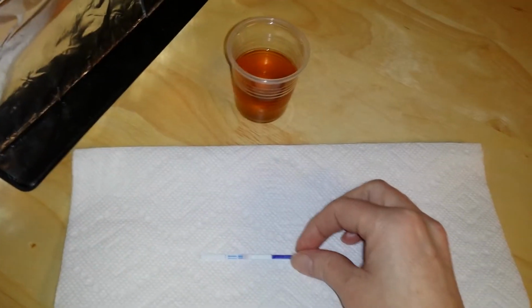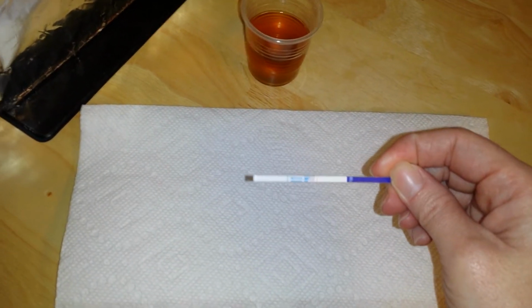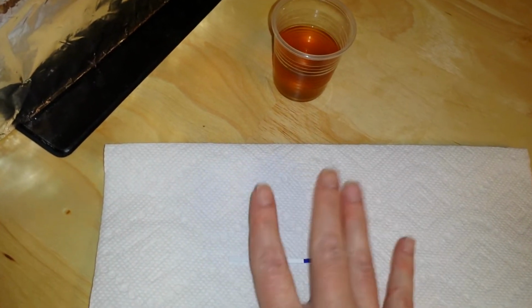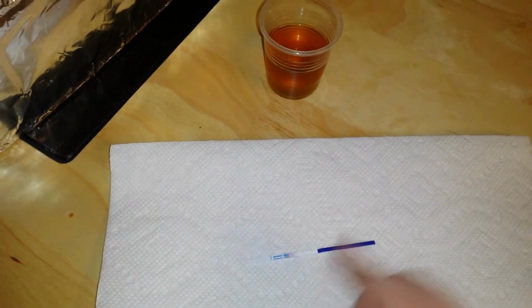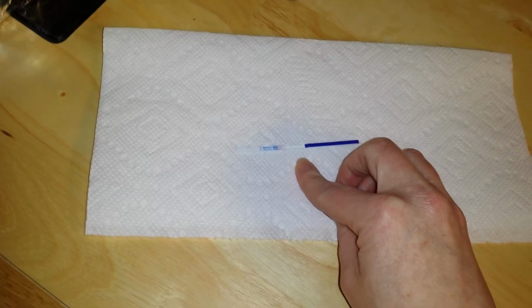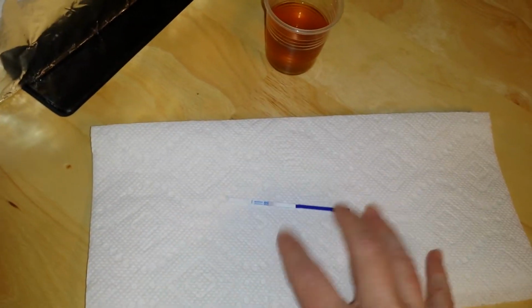For those of you who are new to the whole test strip game, this is a test strip. This is inside of most cassette tests and midstream tests. It just doesn't have the fancy packaging. Usually this will be inside, with the wick where you can dip it, or the midstream test where you put it in your urine stream, or you collect a sample in a cup and put the drops in the well. The urine travels across, and one line is the control line, which is going to react with just about any liquid, including water. That indicates a negative pregnancy test. Whereas if two lines appear, no matter how faint, that indicates a positive pregnancy test, as long as it has color and shows up within the allotted time frame.